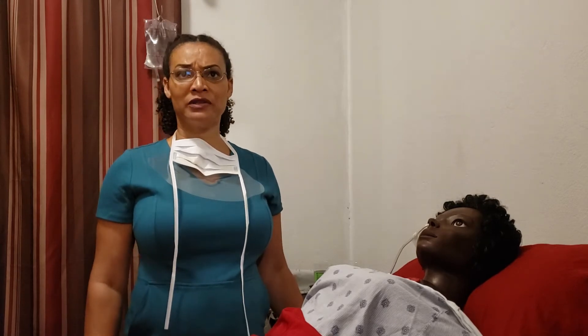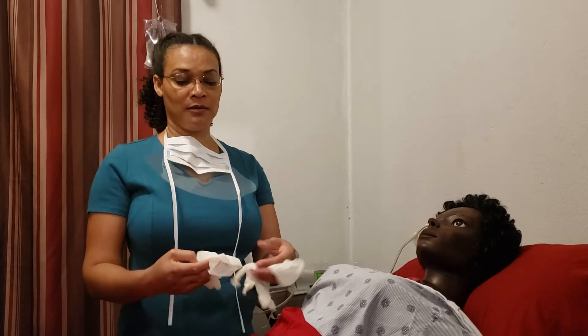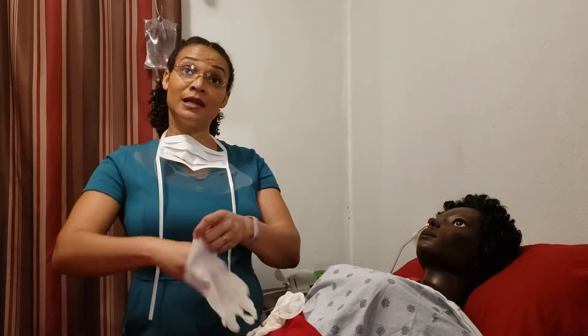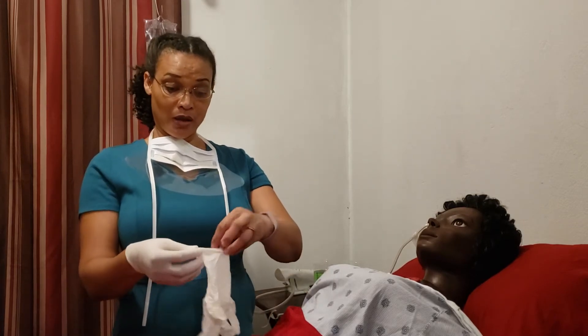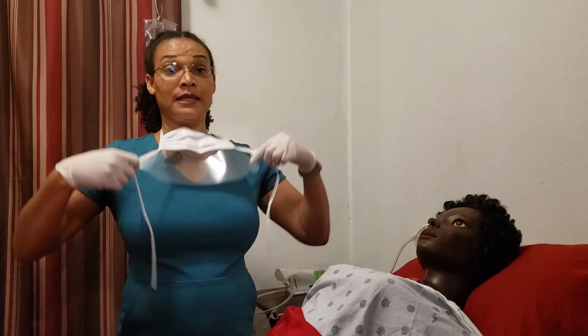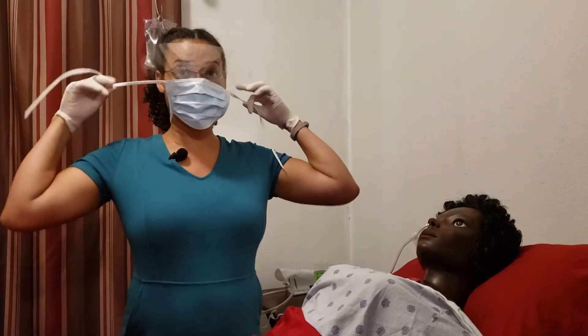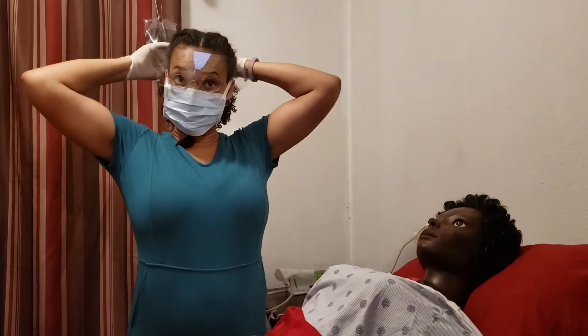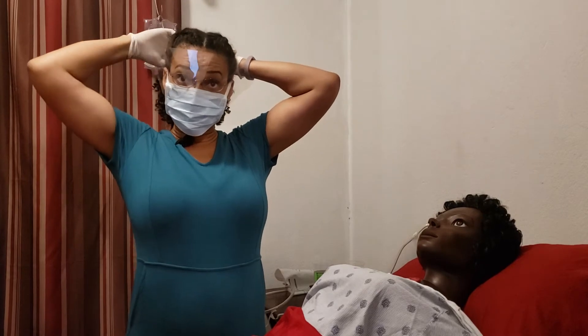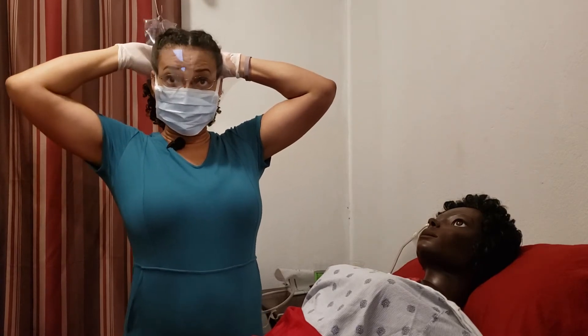Once you've finished introducing yourself to your client and making them comfortable, explaining the procedure and ensuring privacy, you want to make sure that you protect yourself. Because in a procedure like this, it can become a little bit messy. So be sure to don your clean gloves. This is a clean procedure, not a sterile one. And when you've gotten your face shield and mask on, you are going to make sure that you drape your patient.